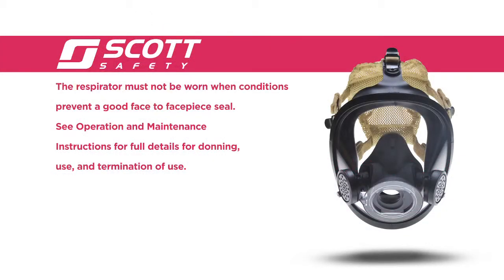The respirator must not be worn when conditions prevent a good face-to-facepiece seal. See the operation and maintenance instructions for full details for donning, use, and termination of use.